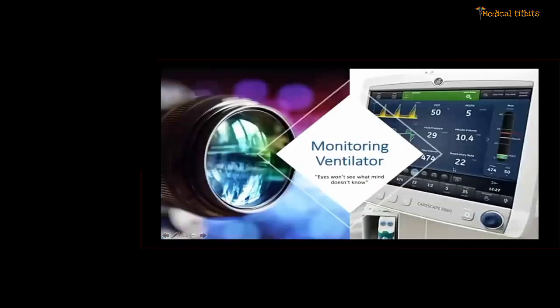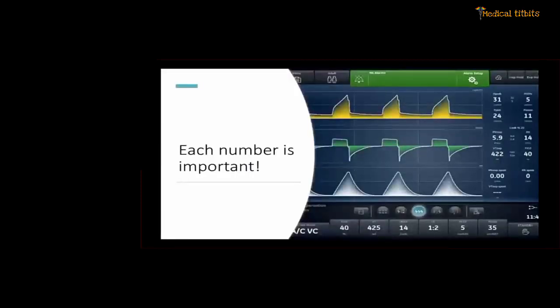Okay. Now, after connecting the patient to the ventilator, you have to keep monitoring the values given on your screen. Eyes won't see what mind doesn't know. So you need to decipher or interpret each and every value appearing on your screen. Each number is important. Here you can see the graph, the scalars. The scalars are graphs plotted against time. Okay, you can see the peak pressure, plateau pressure, minute ventilation, tidal volume, spontaneous ventilation characteristics. These are the set parameters. These are the monitored parameters. These are the scalars and loops.